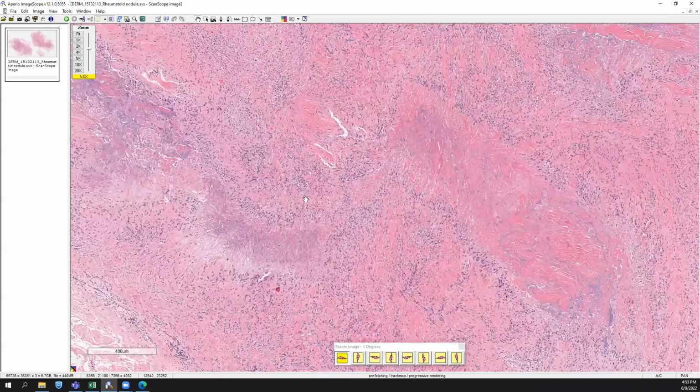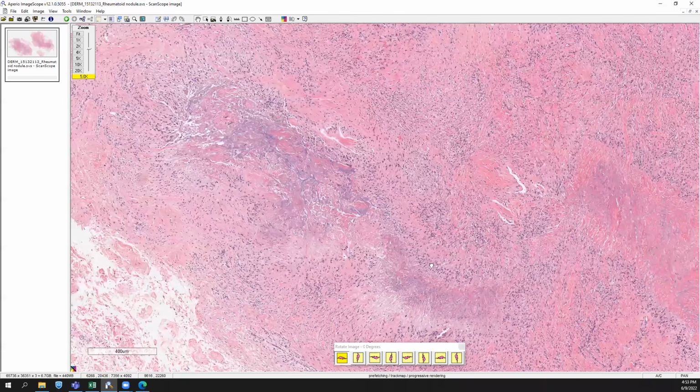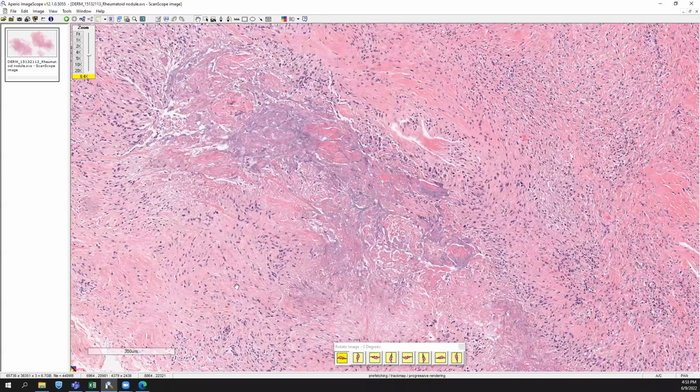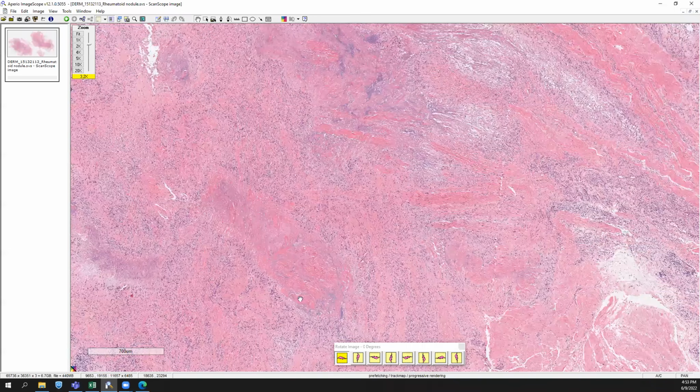proper clinical context. You can see different patterns to the way that the palisading is occurring. It's not always perfectly oval or circular. Sometimes you get these little boomerang shape or moon shaped areas. Again, it all depends on how the section was cut and what orientation, but you'll get these several collections depending on how big the nodule is. So just palisading population after palisading population.